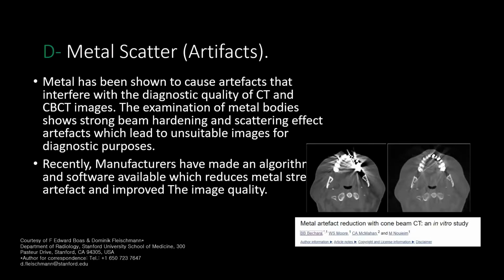More recent CBCT scanning machines have what we call noise reduction technology or scatter reduction algorithms. So they move images from being like this image on the left side to a slightly better image, which is the image on the right side. So we need to really be aware of these scatter artifacts. And in my presentation today, I'll talk to you about novel approaches and methods that we have in order for us to overcome these images and still be able to treatment plan and match our case.